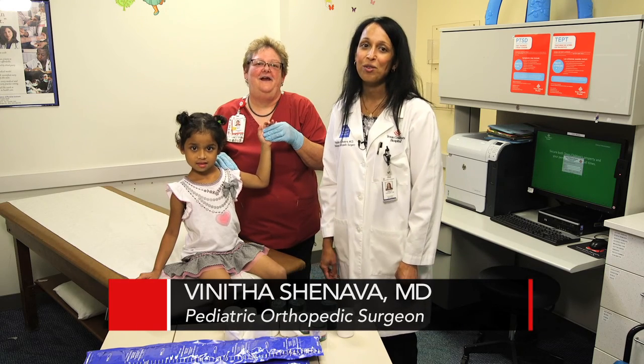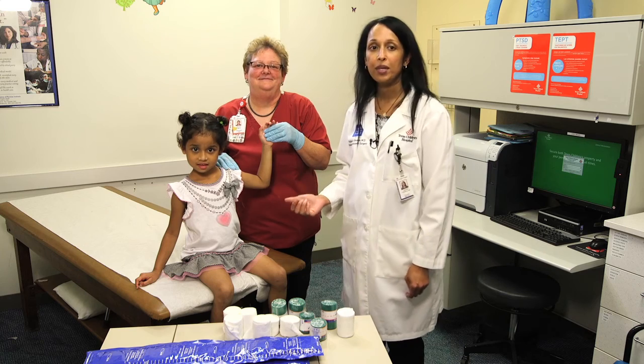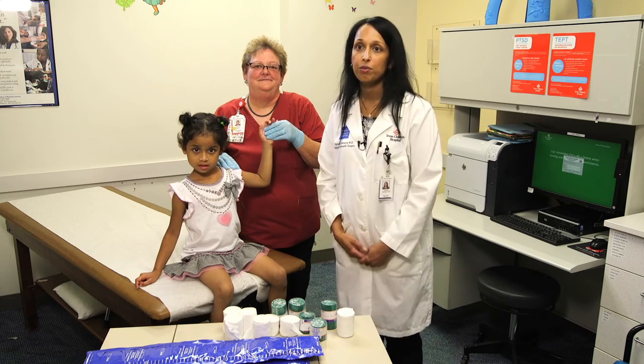Hi, I'm Dr. Shenava, one of the orthopedic surgeons at Texas Children's Hospital. This is Kelly, one of our orthopedic technicians, and we're going to demonstrate to you how to splint a patient who has an upper and lower extremity injury.